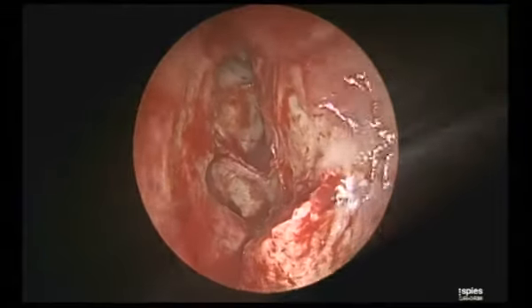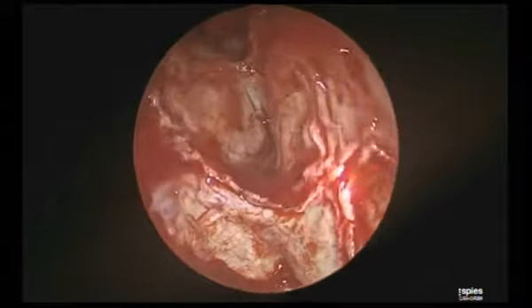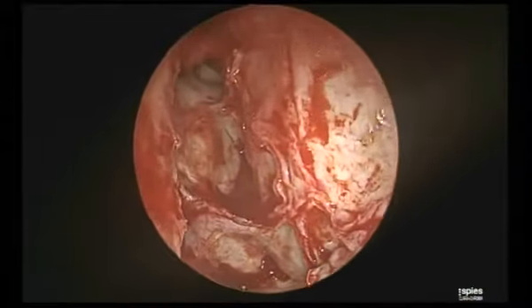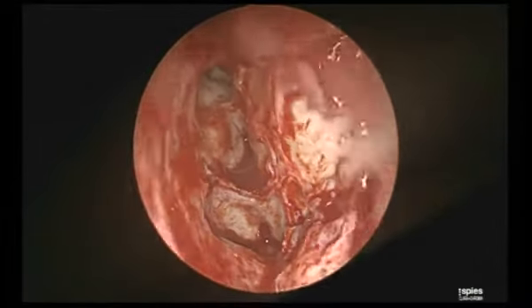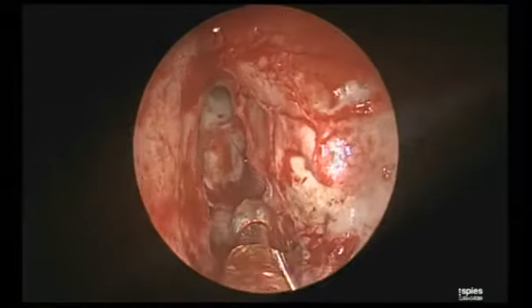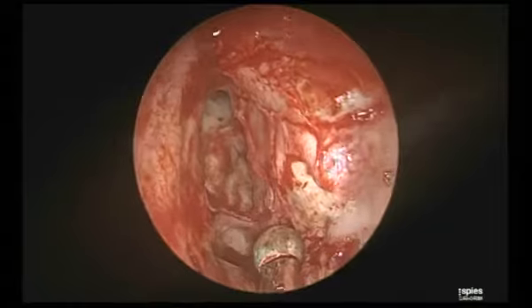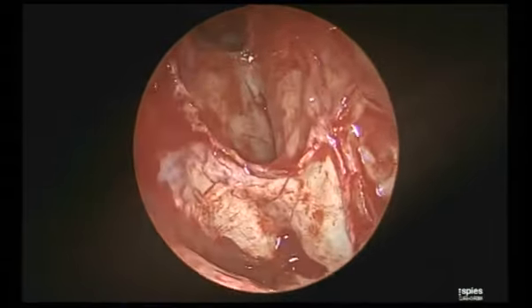Satish, how do you know that is the anterior ethmoidal artery? Yes, it is. See the coning of the orbit. See the supraorbital recess. I told you the same thing during the CT scan. The supraorbital cell is very important. Dr. Deepak Haldipur pointed that out at that time. The positive importance is if you see the supraorbital cell, the anterior ethmoidal artery is going to be immediately caudal.